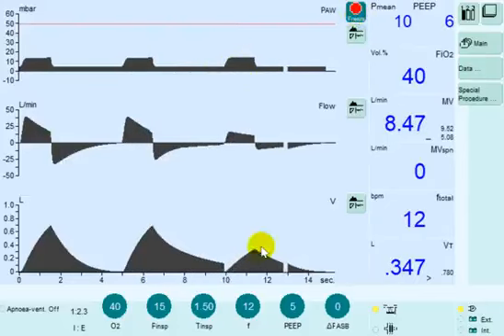The pressure is the same; however, the tidal volume is decreased. Now how do we differentiate whether this is caused by increased resistance or decreased compliance? It would be the same in terms of tidal volume and pressure. So the pressure will be delivered the same and the tidal volume is decreased in both cases.